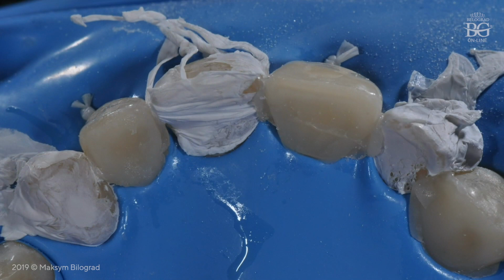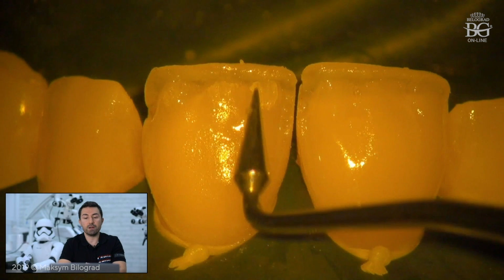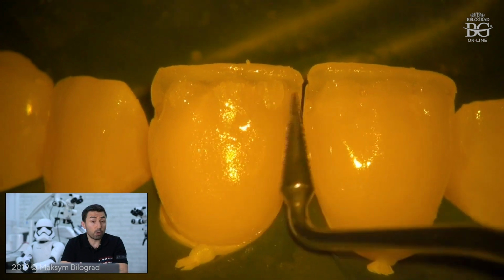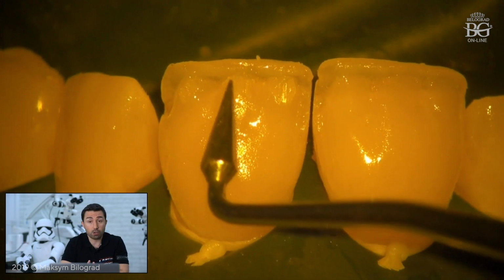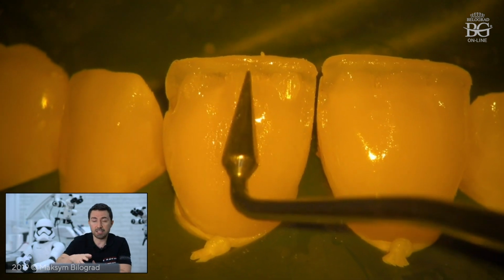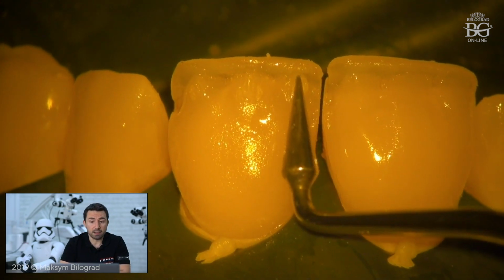So it is not that easy. It is possible, but you will have to spend some time taking this out. So this is one of the options to use this copy-paste technique. Frontal teeth, I mean buccal surface of central and lateral incisors and canines as well, were restored by freehand technique. Nowadays we can also use copy-paste to restore buccal surface, so you can copy nice texture from the wax-up and you do just copy-paste directly.